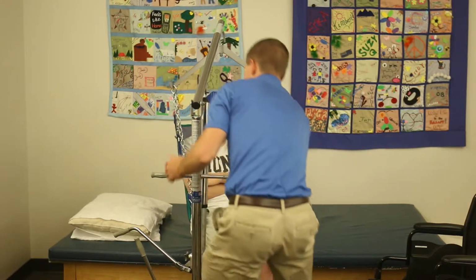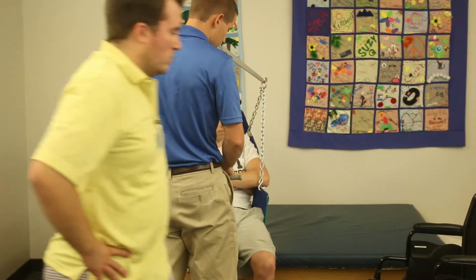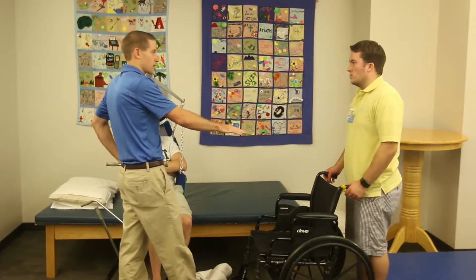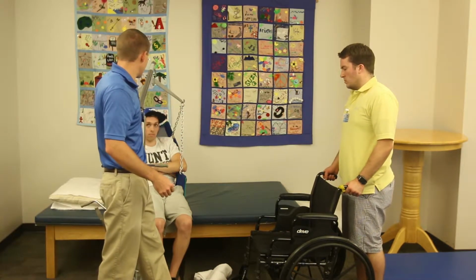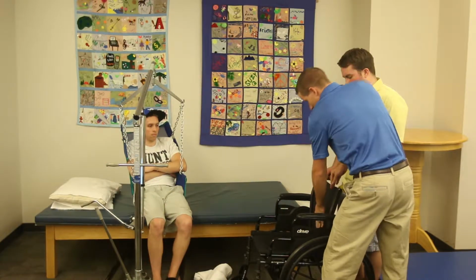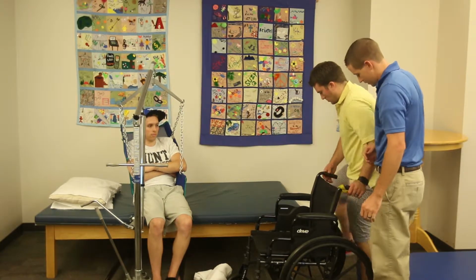There we go. Good. All right, Rich, what I'm gonna have you do is come on the other side of the wheelchair right here. And as I get him back, I'm gonna walk him right back into the wheelchair. I need you to lean it back a little bit, and you're gonna be holding on to the back as we walk over. But as we get over here, I'm gonna need you to hold him back so that his bottom hits the back end of the wheelchair.